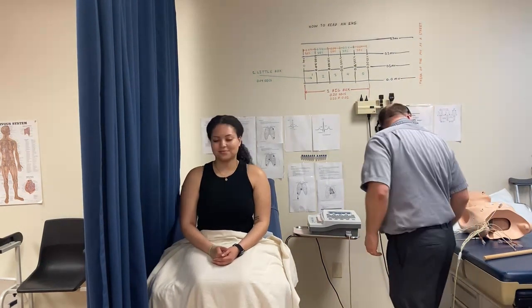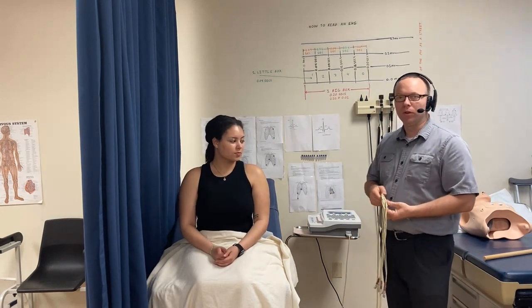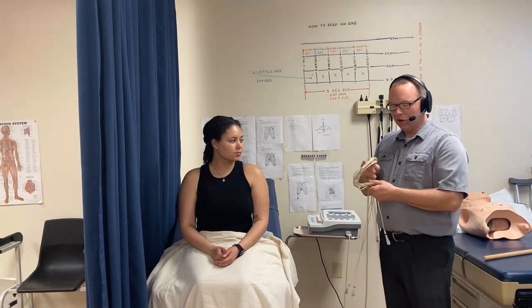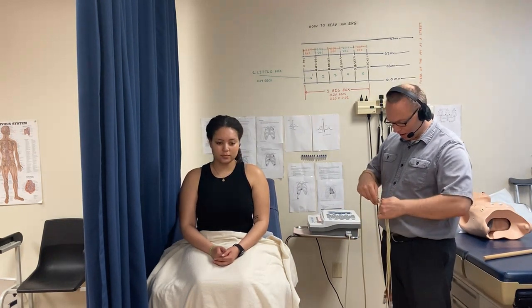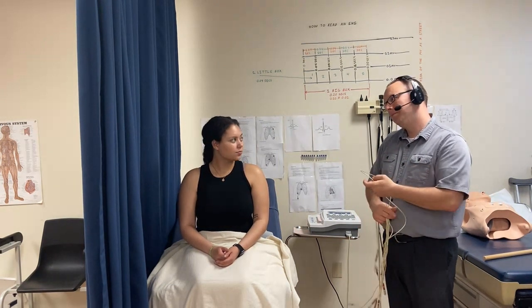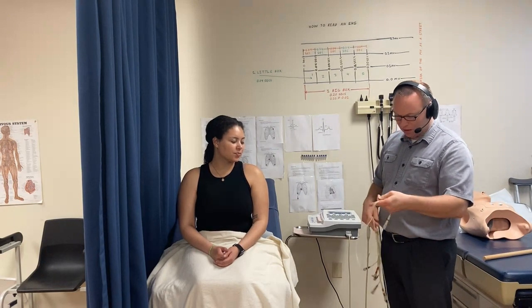Next, you've got your EKG electrodes. Ideally when you put them away you don't want them braided like a rope. You want each of these leads separated, so you've got to unwind them and make them nice and smooth.